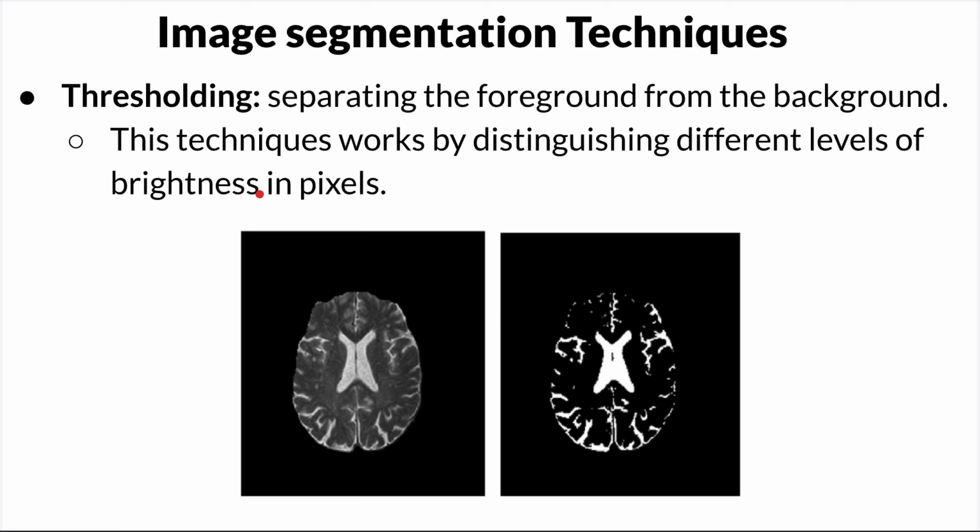That is thresholding, right? So here, if you look at it, you see where the color has deepened a little bit. Okay, so that's thresholding. It tries to separate the foreground from the background using a threshold.